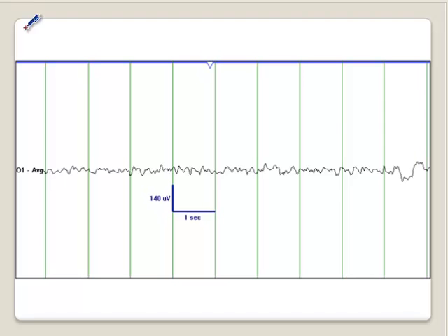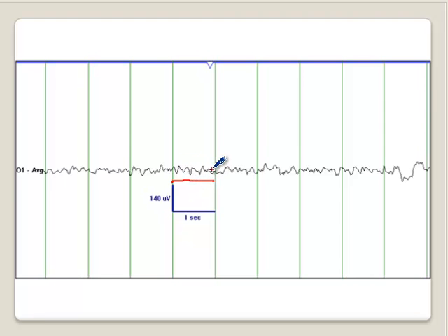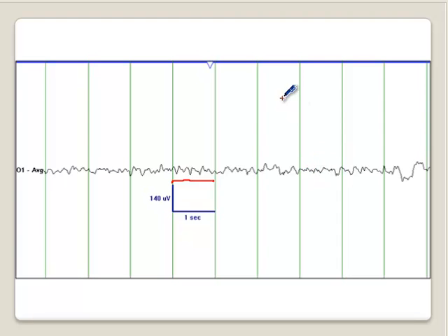Here you are looking at theta frequency — there is predominantly theta frequency, so between 4 to less than 8 Hz, but you see some faster frequencies that are superimposed on the theta frequency.